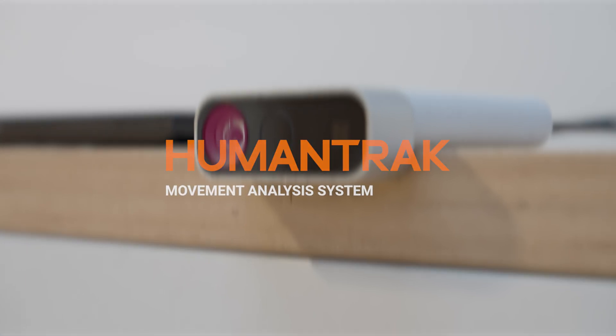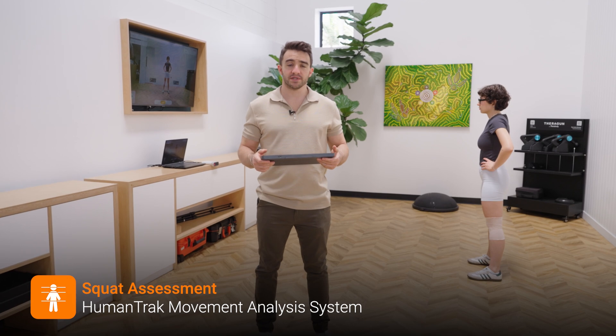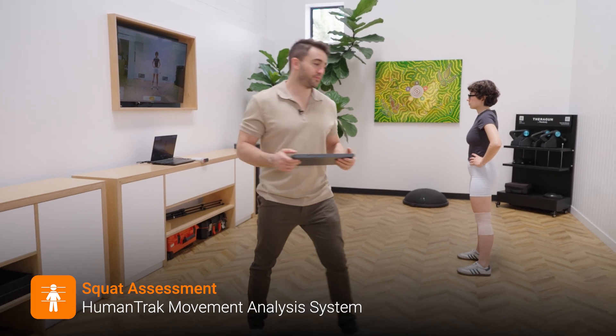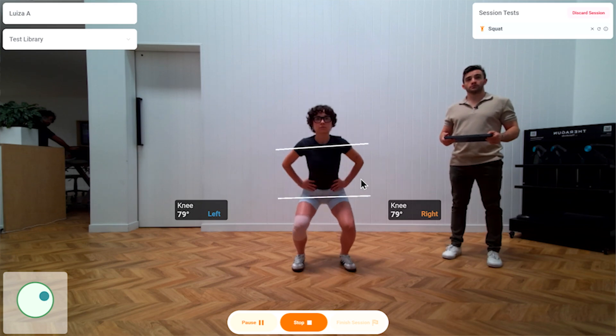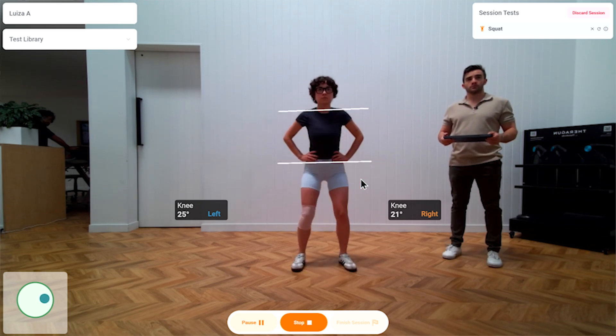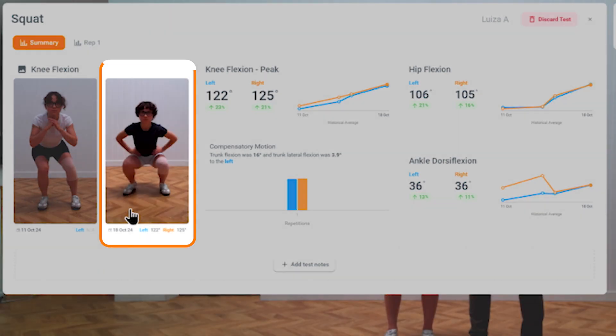Now we'll use the HumanTrack to assess range of motion and symmetry in Louisa's squat mechanics. We've already got previous assessments from the past that we can compare to. Louisa performs one squat, and from the time of her first squat to her most recent squat, her range of motion, mechanics, and symmetry have all improved.